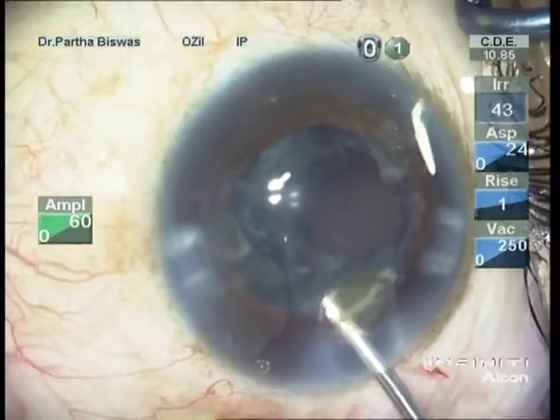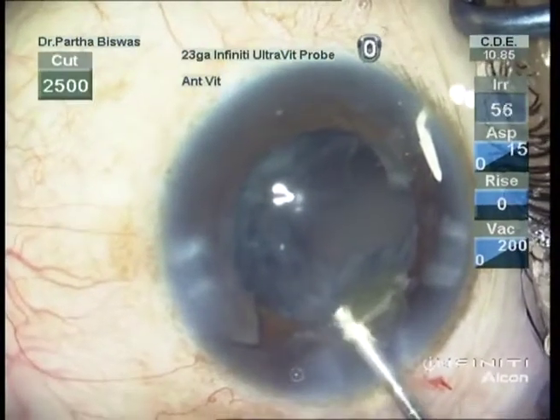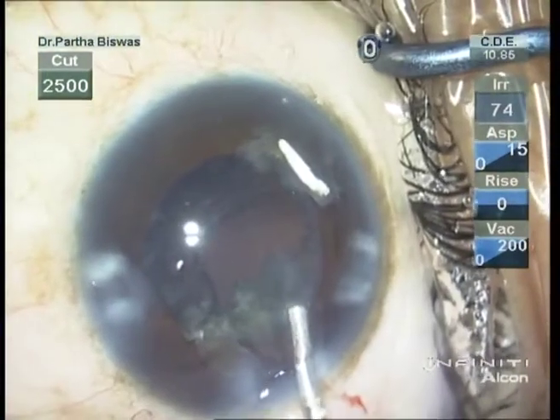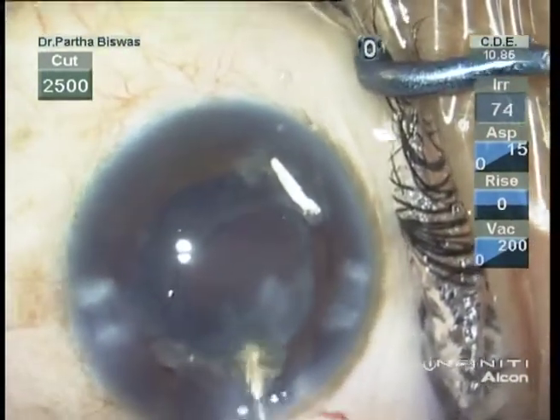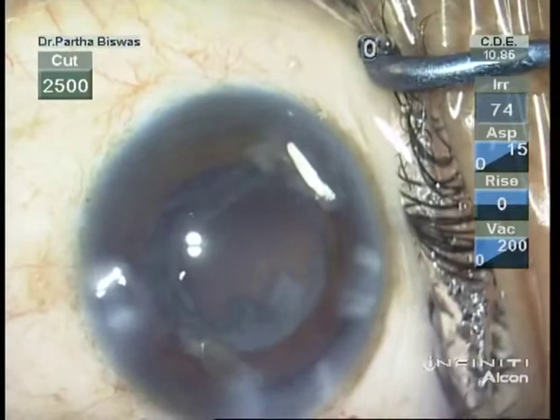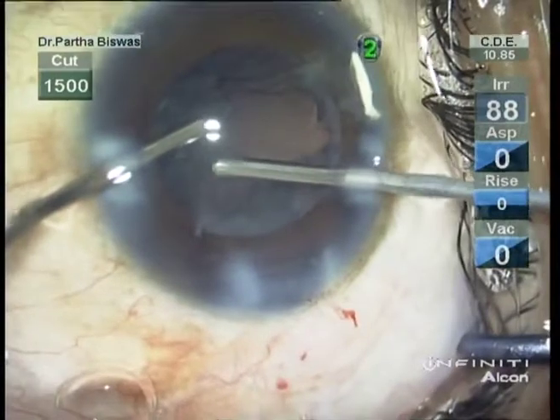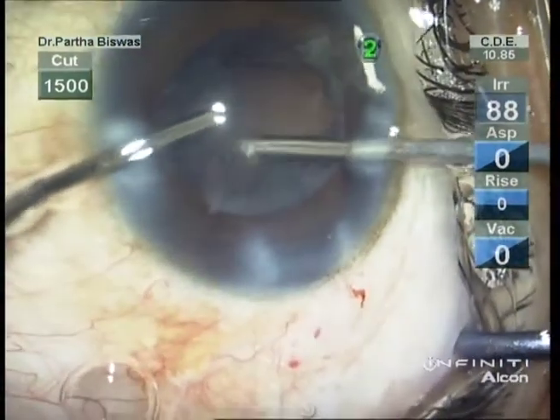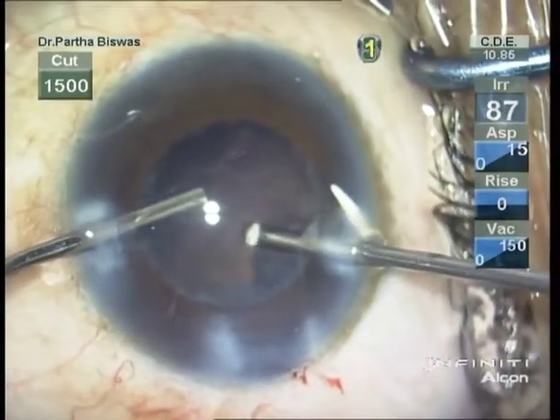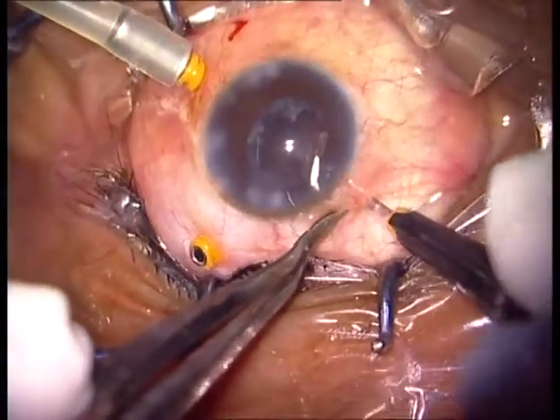The anterior chamber deepens and a significant movement can be sensed. The posterior capsule has given way. Luckily, only the smaller fragments are there, and these are visco-manipulated out of the incision. The implant is lodged safely in the periphery. Next, anterior vitrectomy and removal of the cortex, but maintaining the position of the implant and preserving it. That is done. Now, over to the vitreoretina surgeon.